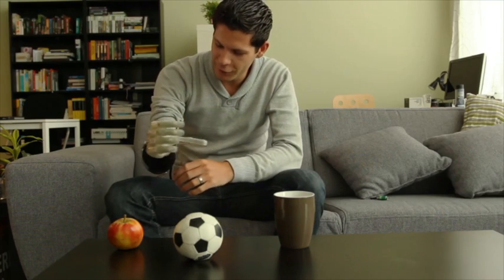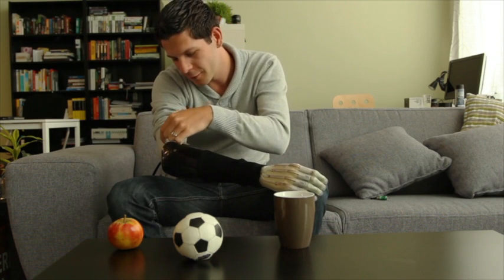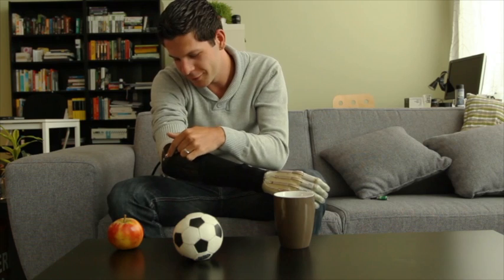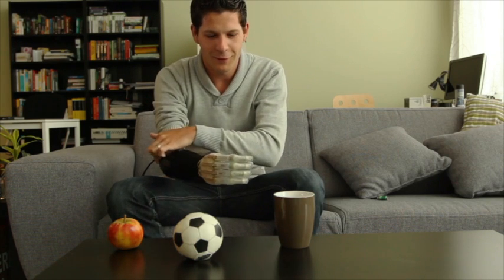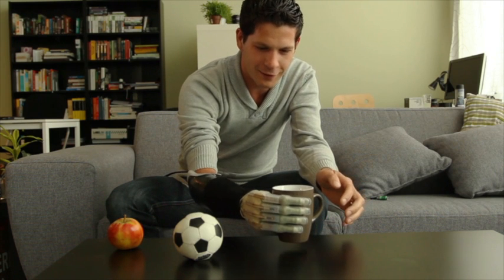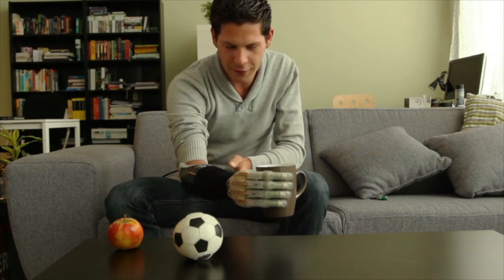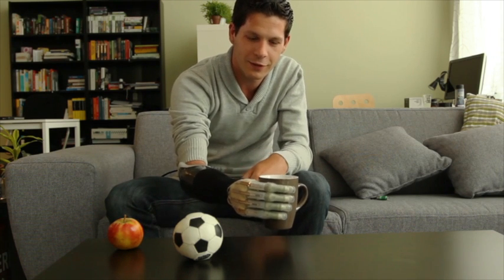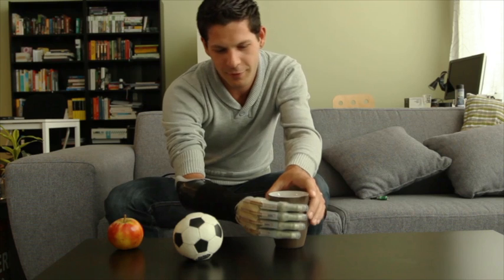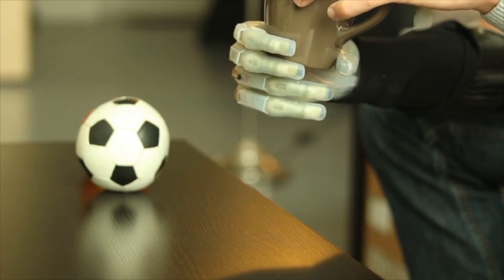With certain vibrations, I can feel the opening and closing of my hand. When I close my hand, I feel the vibration on the inside, and when I open my hand, I feel it on the outside. So when I grab this cup, I can feel my hand closing, and by the intense vibration on the upper part, I can feel that I'm using four fingers. I can also grab the cup with two fingers, which creates a different vibration.